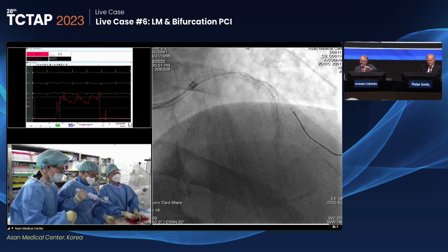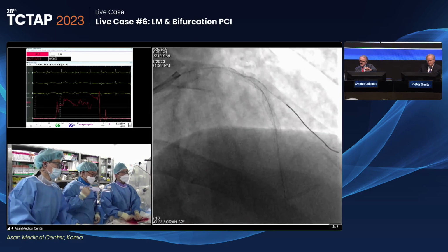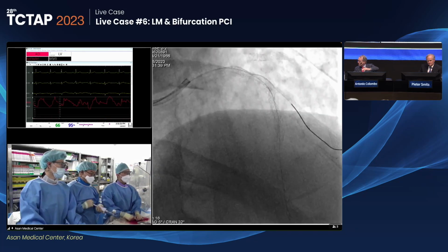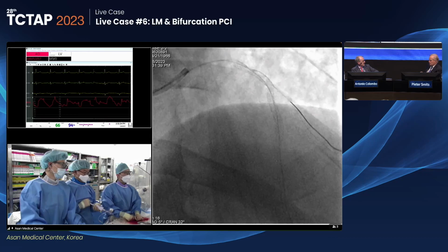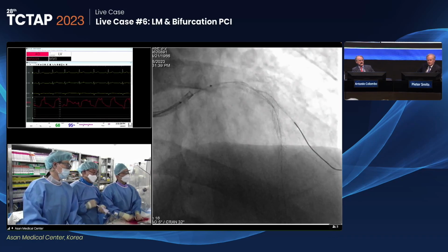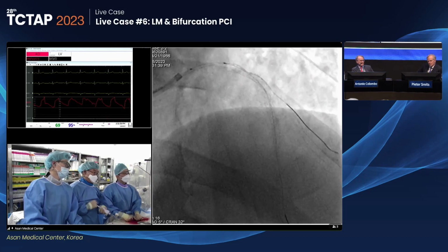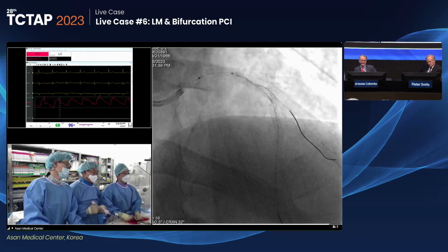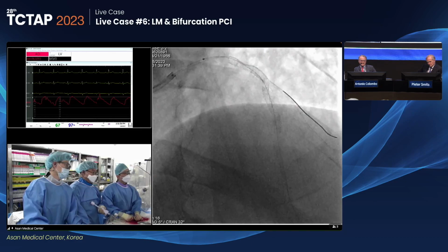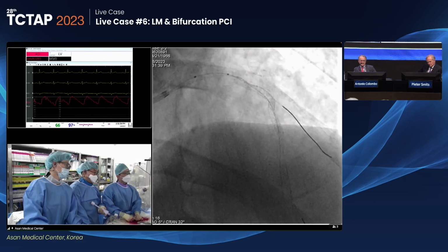When you touch the stent, inflate the balloon at 3 or 4 atmospheres, and it will move the balloon a little bit. Or just use a semi-compliant balloon. Take the nose out of the struts at the beginning of the stent, just at low atmosphere, 3 or 4. Or use a semi-compliant balloon, so you might get around it more easily at a very wide angle.